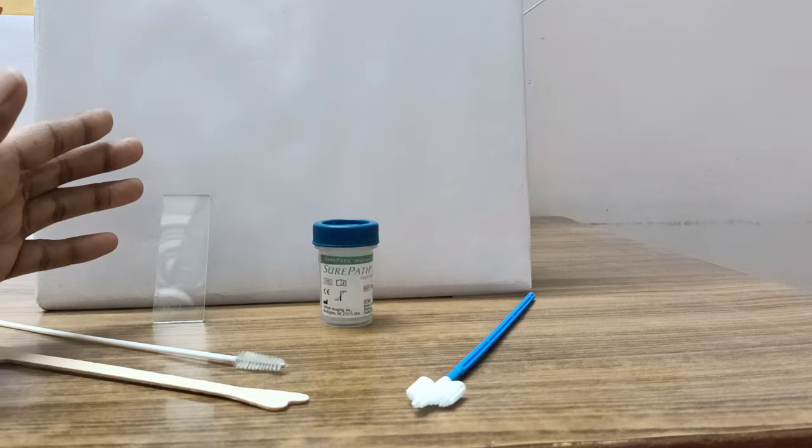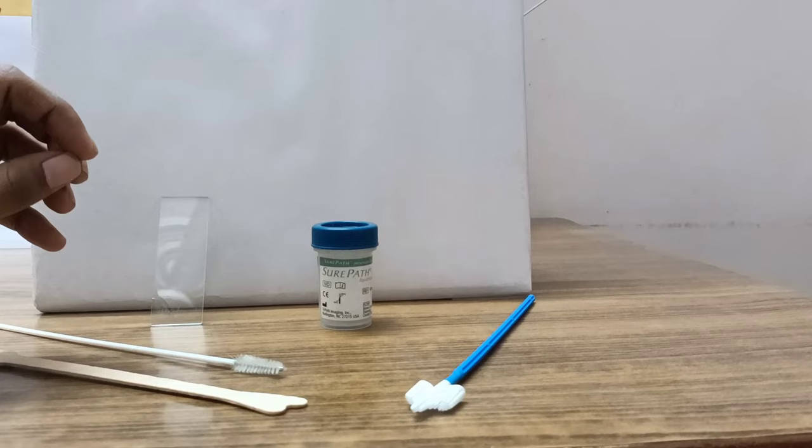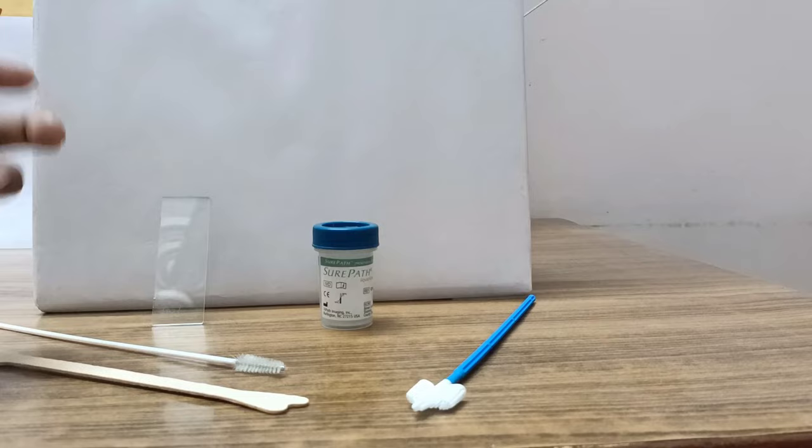While inserting your Cusco's speculum make sure that you do not use any lubricants or antiseptics before inserting because that will hamper the cytology report.